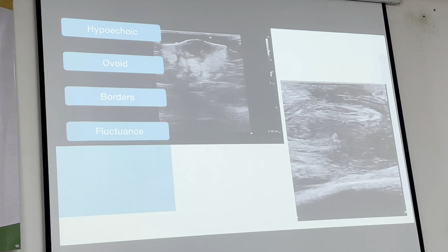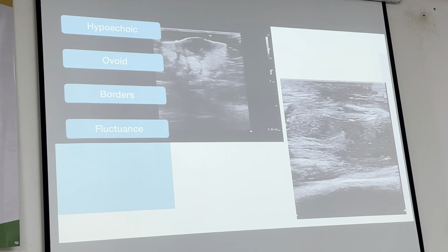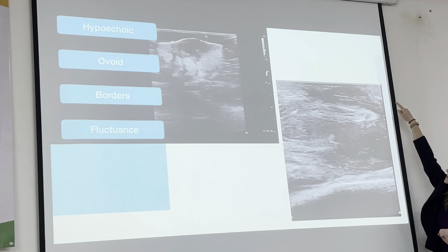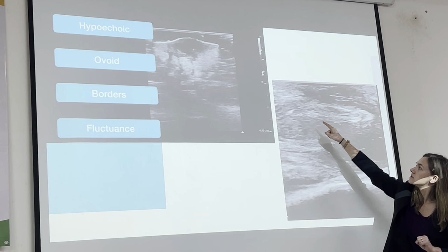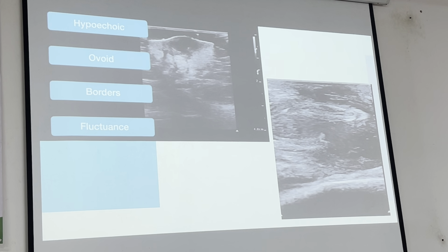Some elements of the last, similar to the last image. We again are looking for how thick this dermal epidermal layer is. It looks thicker than that original image. And then here, you are getting some localized edema. We're not quite seeing the cobblestoning as we did before.